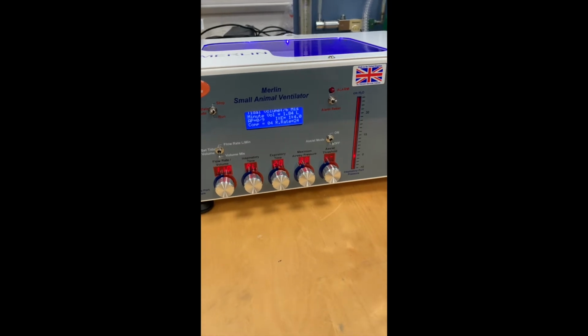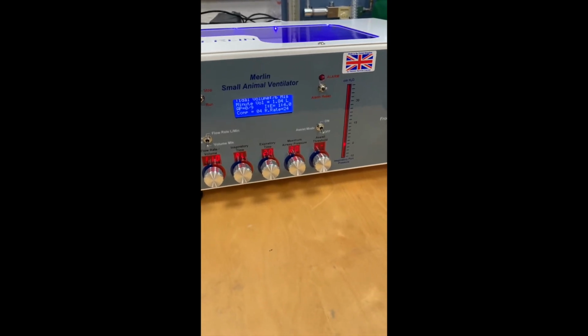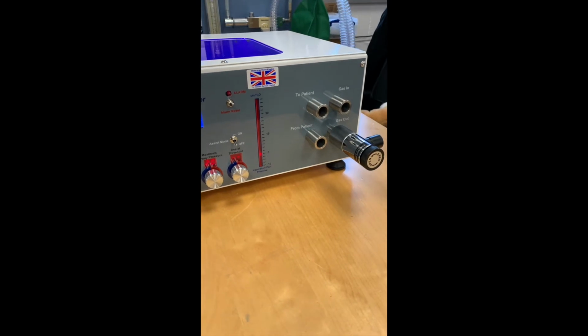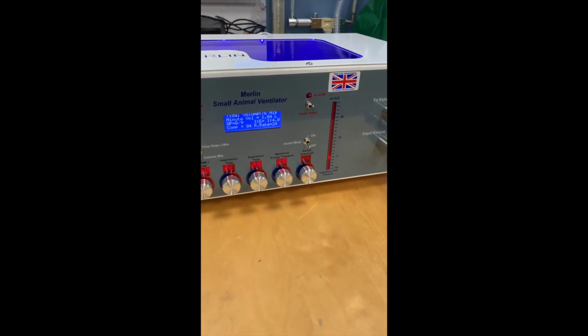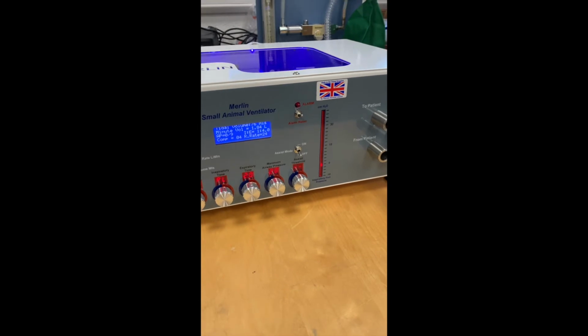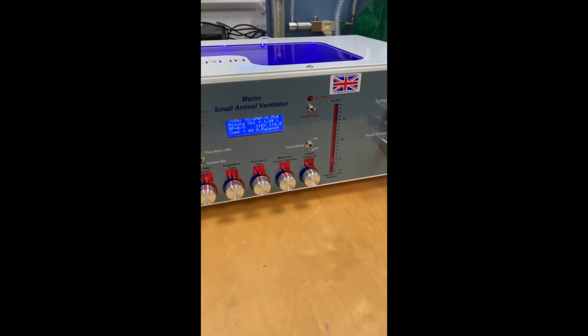We'll now have a look at how to use Merlin. Merlin is a volume support ventilator and can be pressure cycled or volume cycled. It can be run in a rebreathing or non-rebreathing configuration. It can have PEEP and assist modes. In its simplest form, with volume cycling and non-rebreathing configuration, I believe this is the most likely configuration for humans with COVID-19 infections. So here's the setup.